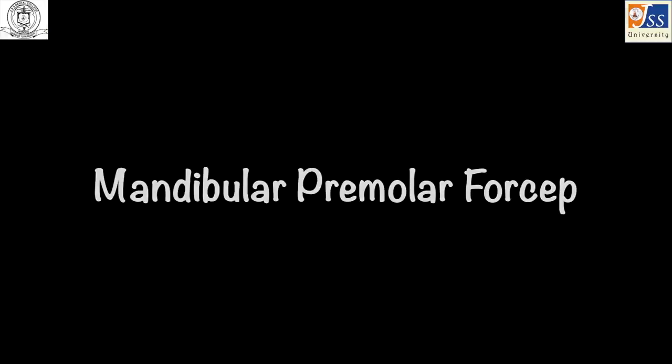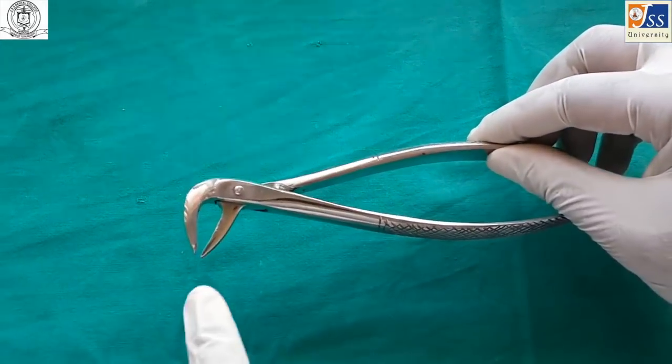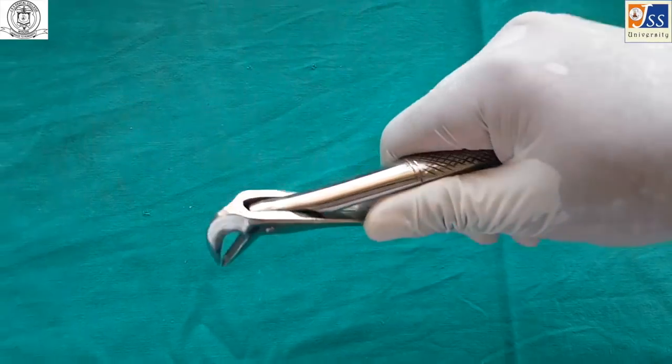The mandibular premolar forceps is used for the extraction of mandibular premolars. It is much similar to the anterior forceps, but the beaks do not come in contact.